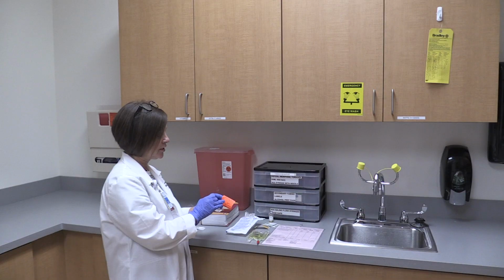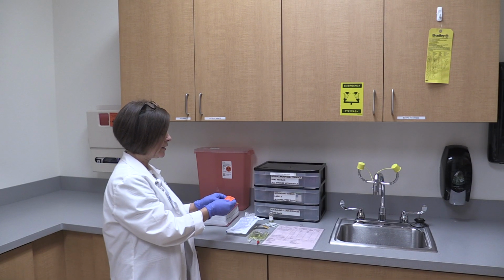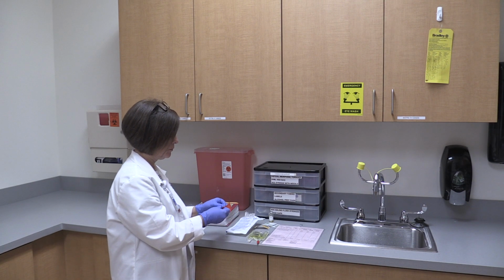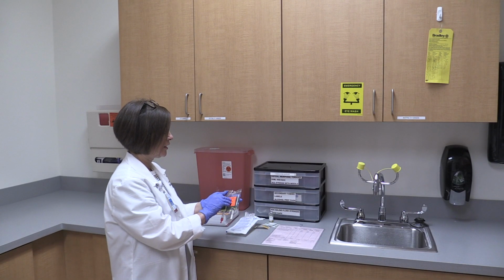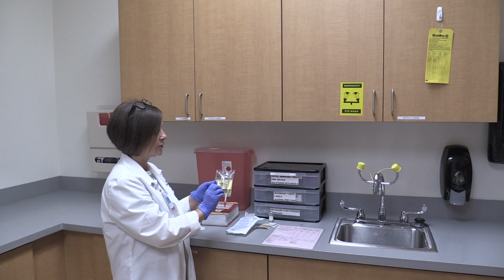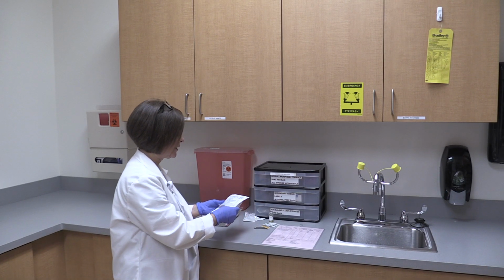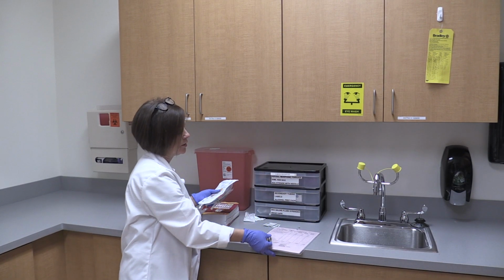So now that I have this complete, I'm going to go ahead and label my bag. Make sure that I have the patient name, room number, the drug, the concentration, my initials, and the date and time. I'm going to put this on the back of my bag so that I can still see on the front that it is the normal saline. I'm going to take my supplies and I'm going to head over to my patient's room.